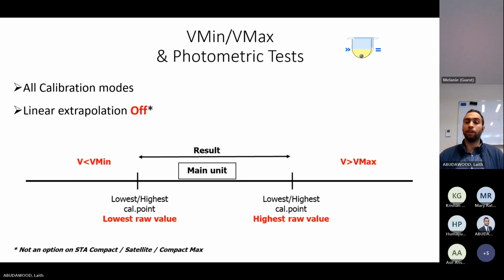For example, with factor assays, the longer the clotting time, the lower the concentration of your factor. So if a factor assay gives you MMax, this means the concentration of the factor is very low. However, the opposite, for example D-dimer: when you get MMax, this actually means your D-dimer is very high. So how do I know when MMax means very high, when it means very low, or the opposite for MMin? The way to know is to know exactly the principle of the assay.